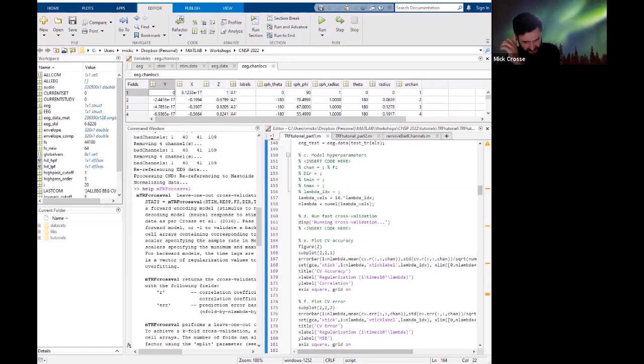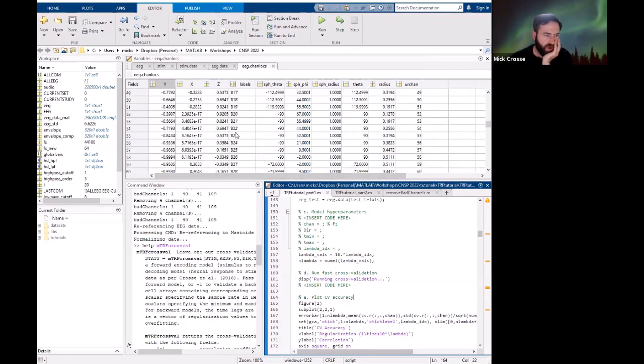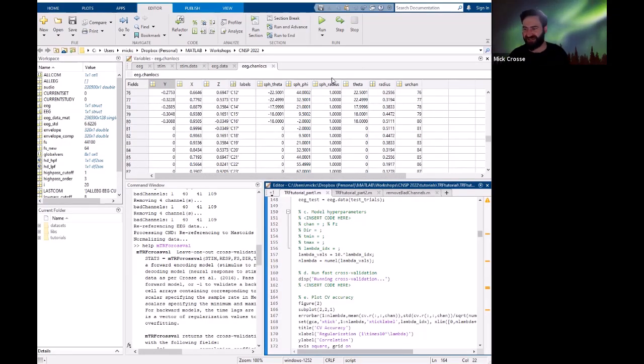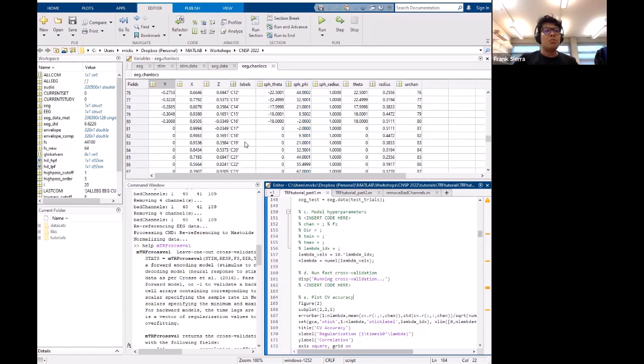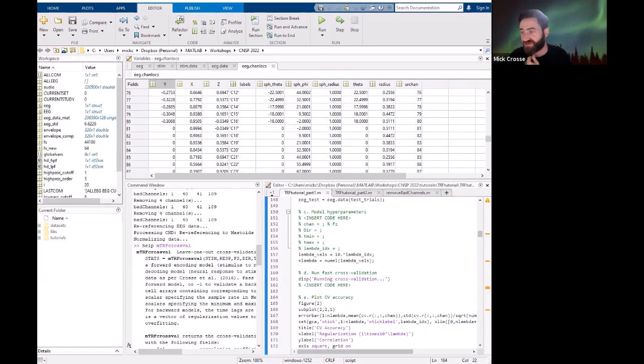So someone's asking, are the channel locations the 10-20 electrode system? I'm not finding FZ. Oh, I apologize. Sorry, yeah, FZ won't be there. Okay. Sorry, can we input just the numbers of the channels, or do we need the names? Do you know what, FZ, just because it's not that important, FZ is channel 85.